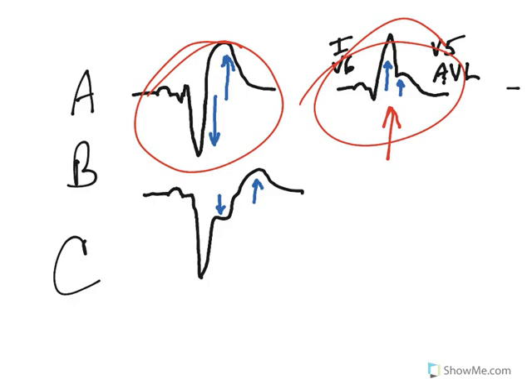No, I did all right. That was fine. What I just didn't label was this guy right here. So I got my QRS going downward, I've got my ST segment going downward, my T wave is going up, and we think, well, that's good, that's discordance, right? No, that's not discordance. No, no, no. Because we have concordance of the ST segment and the QRS.